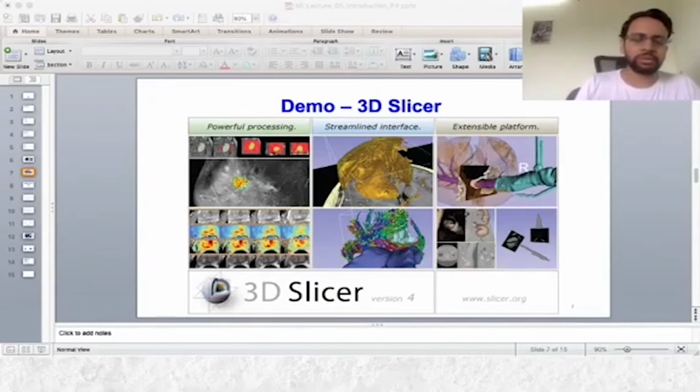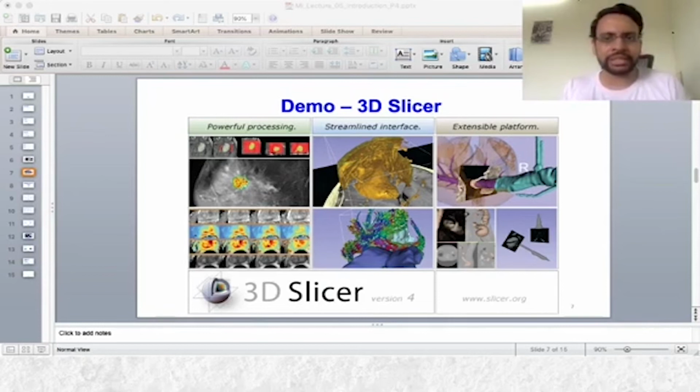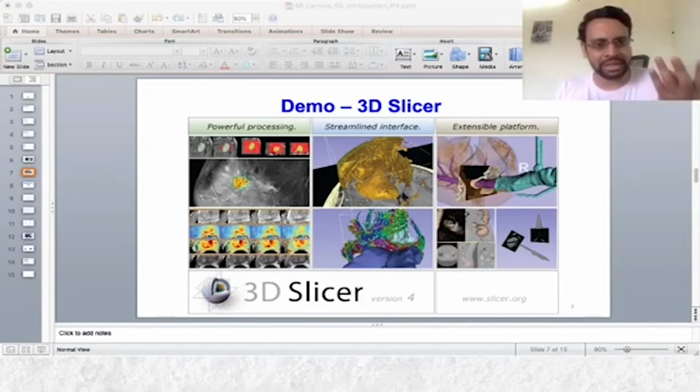And now if you want to do very serious programming in medical imaging, one of the best tools and my favorite tool is the Insight Segmentation and Registration Toolkit. It's an open source cross-platform library, and this is a widely used one. And two tools that we have seen, ITK-SNAP and 3D Slicer, are built upon this tool.